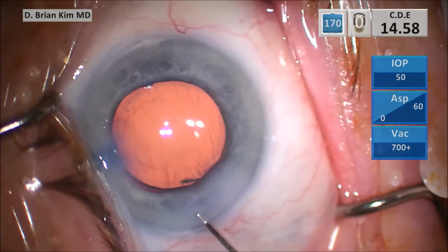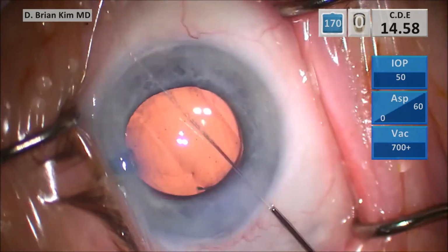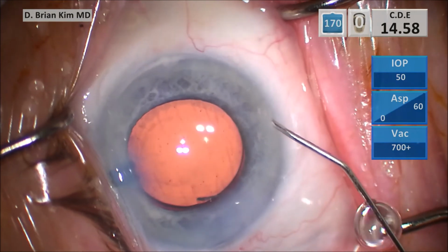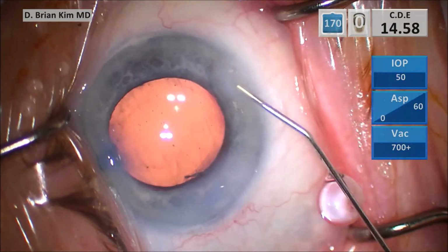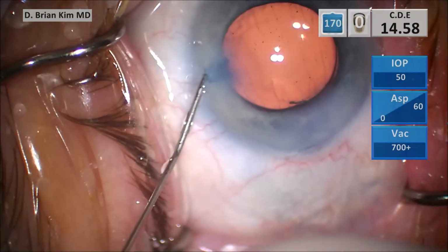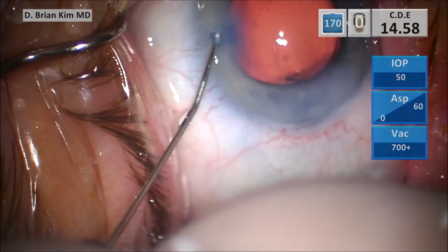And then you saw I did cross chop, where I was able to place the chopper around the right heminucleus, pulling it centrally toward the phaco tip, fracturing the lens against the phaco tip, which is deep in the bag. And I do this over and over again to remove those lens pieces. This is a very controlled way where you can fracture the lens from any different angle. That's why cross chop is so versatile.